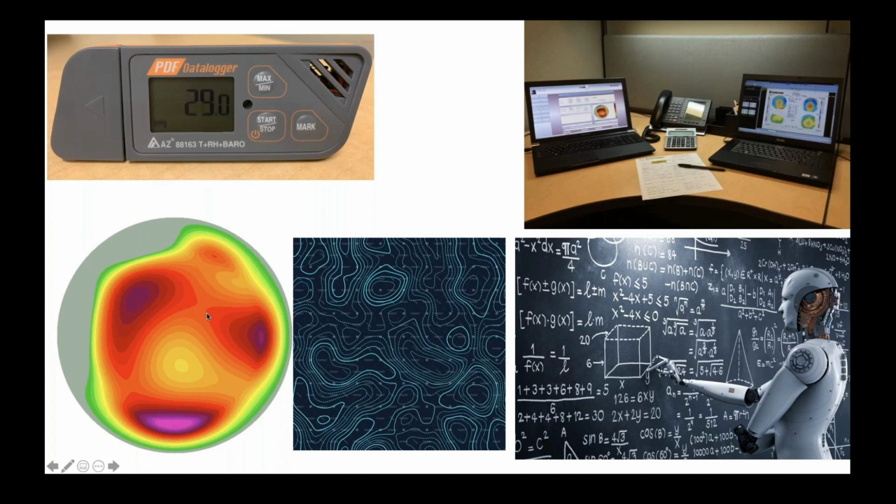In the near future, again, we're going to have an export tool from Alcon that's going to have not only 100% accurate data transfer of names and numbers, but a much higher resolution of this topography map. And using a higher resolution map, we're going to use more advanced mathematics known as differential geometry to become even more accurate in helping you get the perfect treatment for every single eye. And finally, once a surgeon has entered enough of their Contura cases, their post-op results, into the Phorcides cloud, we have experts in artificial intelligence who have built in artificial intelligence to help modify your surgeon-specific nomogram, something no one else in the world has ever done for surgeons.